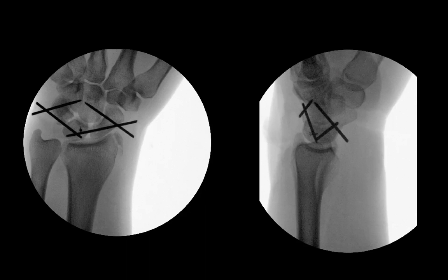Normally, it's 2 to 3 months for this to heal. I think the alignment you have is excellent. The things you should think about when you do cases like this in retrospect is, what's attached to the radial styloid? Why is my anchor so close to the middle of the lunate and so far from where it normally should be? And why did I put a pin from the triquetrum into the hamate? You should think about that so that the next time you do it, you have a better idea. You should know why you're doing what you're doing, because I'm not really sure why that pin is there. Even though it looks perfect, you should always critique it so you prepare yourself for the next time you come across one of these.